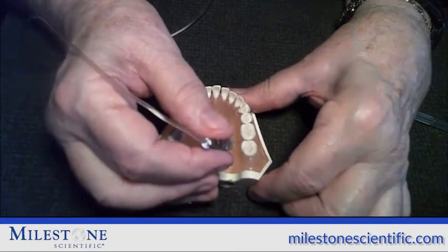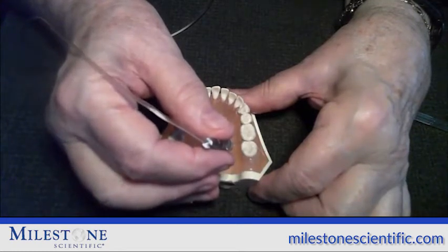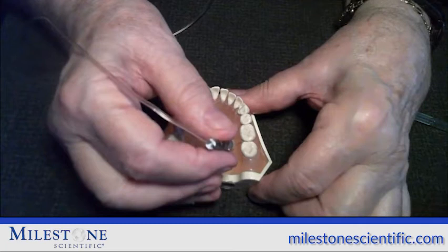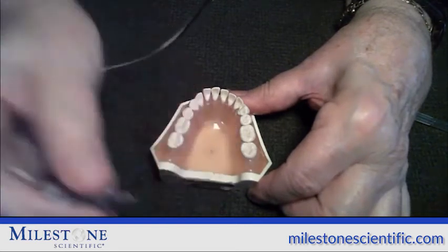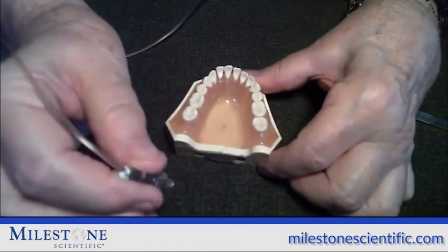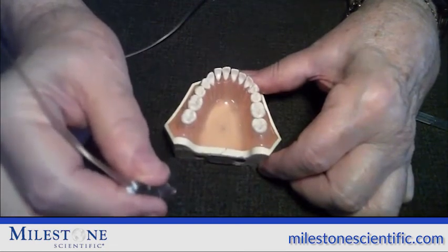So once again, when we want to pull out of the tissue without getting anything into the patient's mouth and determine how much pressure we put on that needle, we hit the foot pedal, release it. It goes into aspiration. During aspiration, after the 3rd beep, we take the needle directly out of the tissue. So it's beep, beep, beep, 1, 2, 3, take it directly out, put it on the patient's bib, put it on the bracket table, and watch and see how much anesthetic comes out as the aspiration cycle finishes.